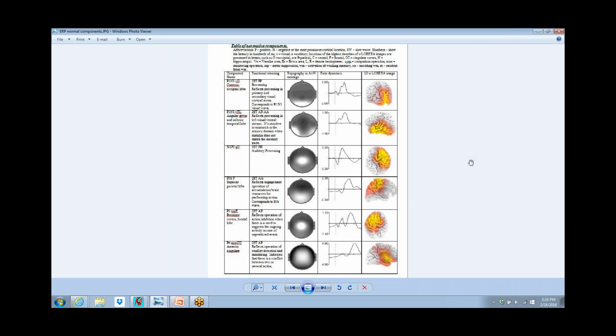There are those that have databases that don't have tasks in them that claim that tasks create so much variability that we can't do them and get a database, when in fact it's actually been shown that tasks constrain the otherwise fairly random choices the brain might have as to what state to be in. And tasks actually reduce variability. The at rest has a lot of variability because there's no constraint on what you do when you're sitting there told to rest. There are some people that do eyes closed meditation, and that's not eyes closed resting. It's not the same thing.